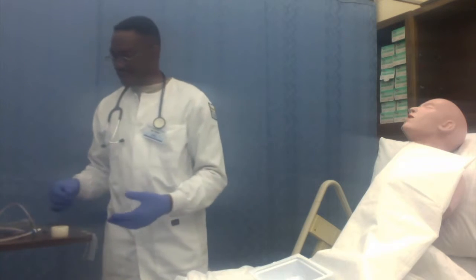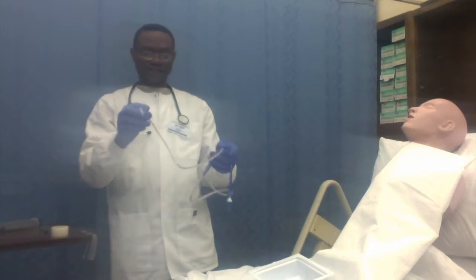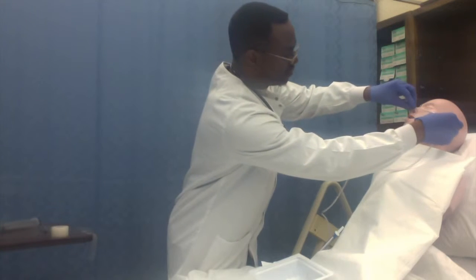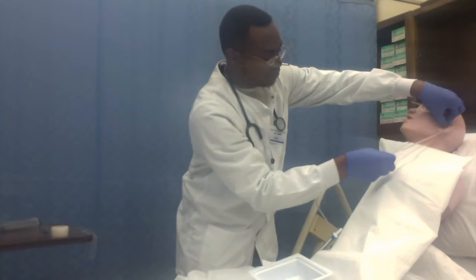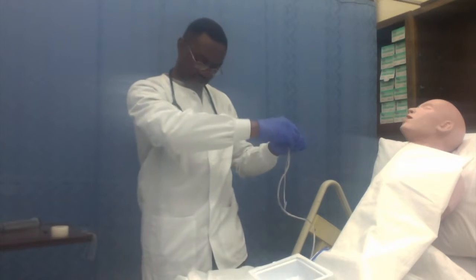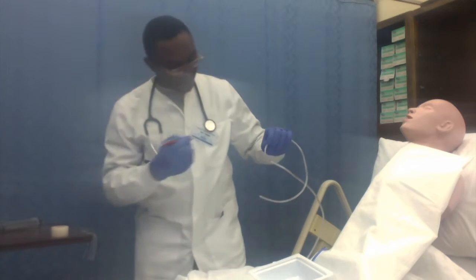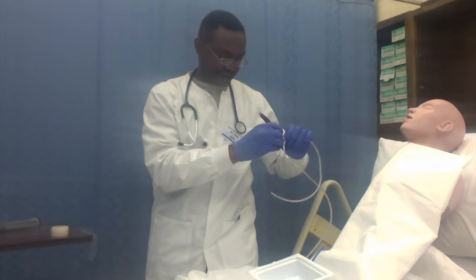Now I will proceed by measuring the tube to see how much of it will be inserted into the patient's gastric region. I will measure by starting from the tip of the nostrils right to the tip of the earlobe and then down to the xiphoid process somewhere here. And given that my tube is not calibrated, I will use a marker to mark the distance of the tube that will be inserted into the patient.